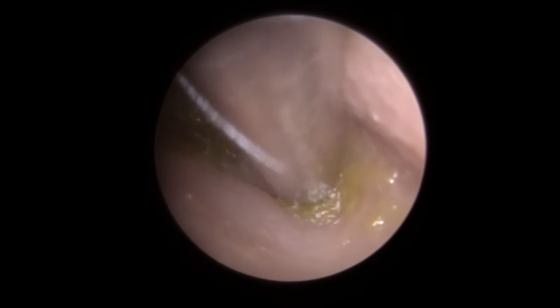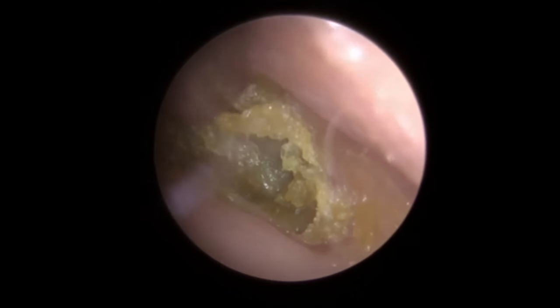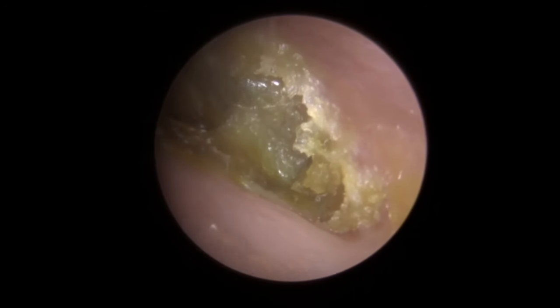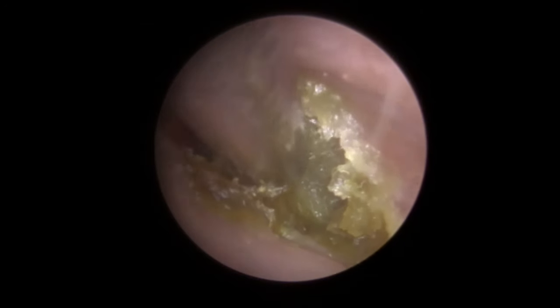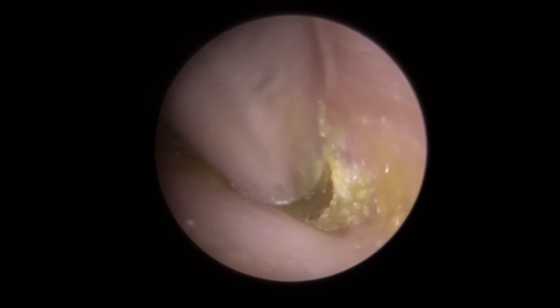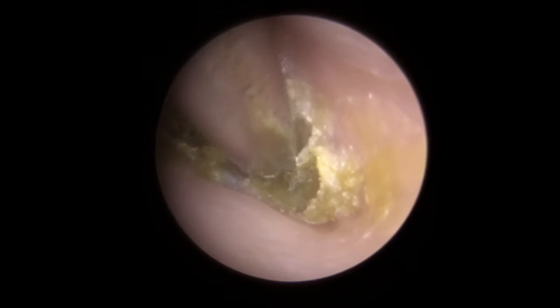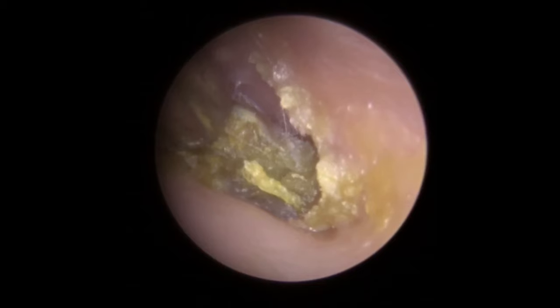You can see we've got a very, very deep section of wax and skin down really, really close to the eardrum. A complicated case because the skin isn't always the easiest to remove. We have very, very little room to manoeuvre — a very, very narrow canal. Everything impacted right down on top of the eardrum, so just an absolute nightmare to try and remove. But what you can see here, we're just trying to tease this skin apart, trying to pull these sections down. You can see it's really, really firmly attached — and that happens a lot with these kind of skin issues and very dry wax issues.